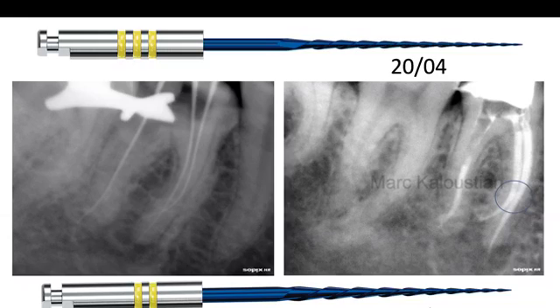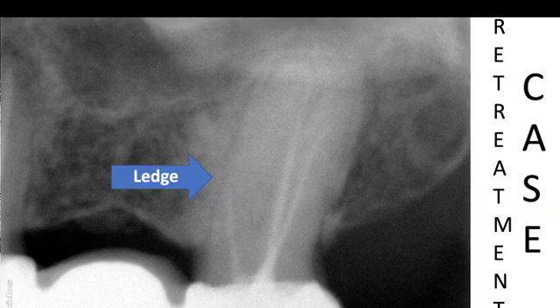As you can see, we have a curvature. It's not a very acute curvature, but sometimes this kind of curvature is even more difficult than the acute one, because we don't see them, so we don't pay attention and we create a ledge.